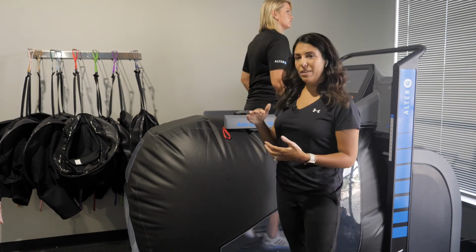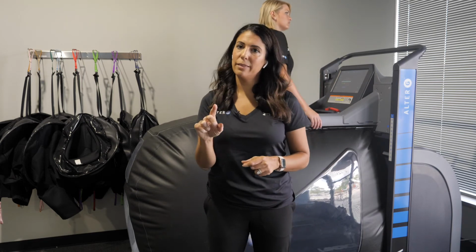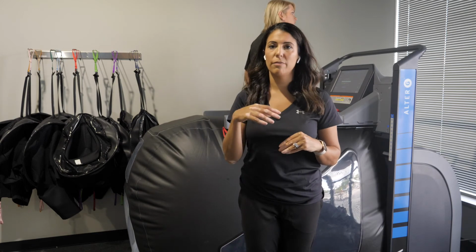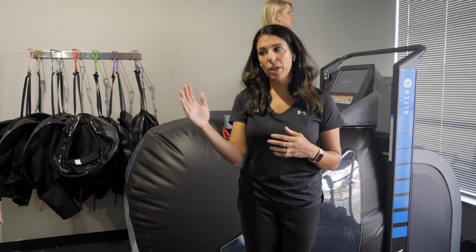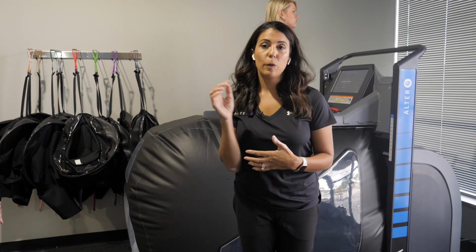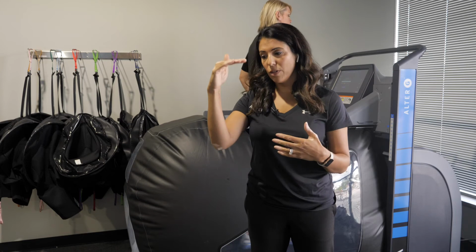So at any point throughout the session, you can press pain, have your patient record their pain level, and the machine will automatically record those levels. At the end of the session, you'll be able to see at what body weight percentage, what speed, and at what point in their walking, so maybe it's after 5 minutes, maybe it's after 8 minutes, that their pain was the lowest. And it'll be graphed out on 3 separate graphs.